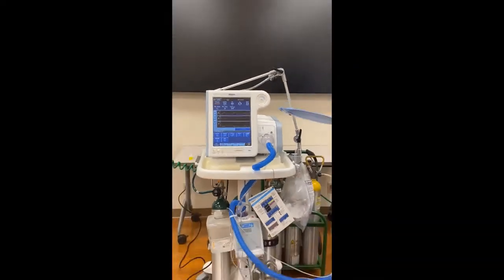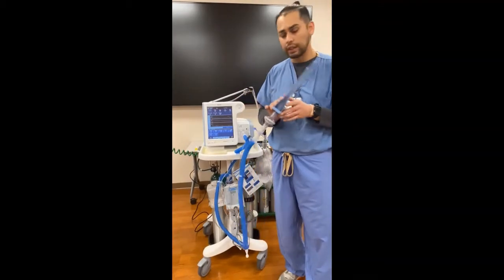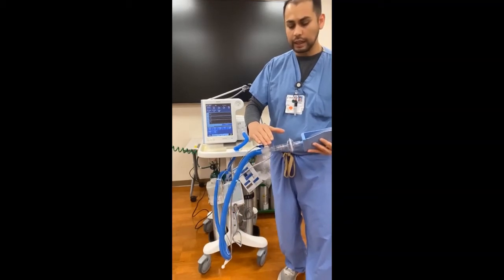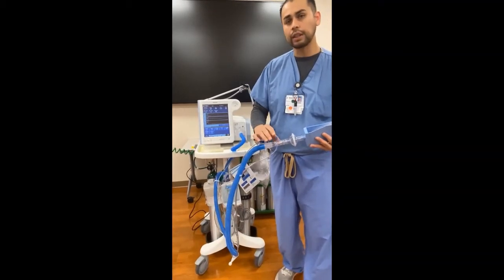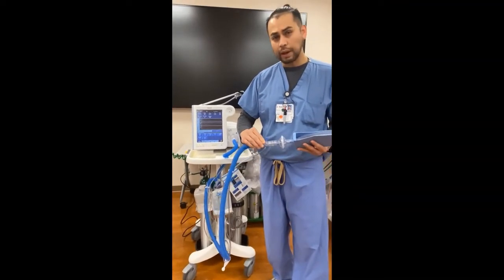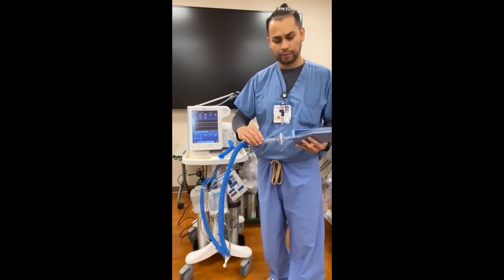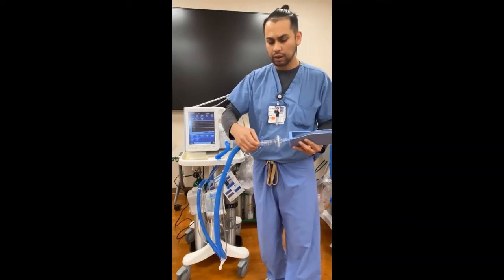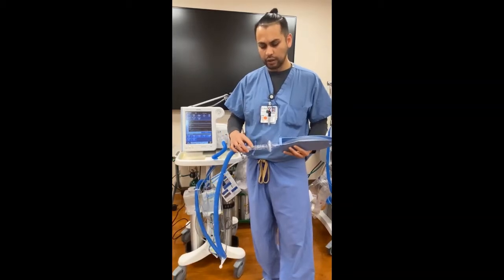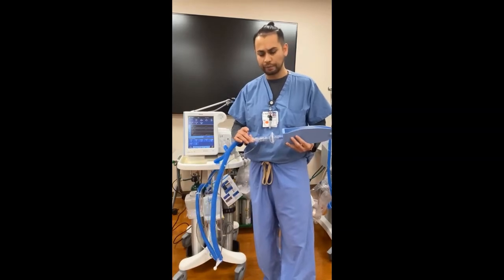Now, as you notice, we have a test lung attached to it, and we have the corrugated tubing, it's one single tube, and we have a little bit of pressure, a little bit of air that is leaking out of here. This is important to keep open. We do not want to occlude it because that will be bad for the patient. They will accumulate CO2 because this is their exhalation port. Anytime the patient is able to breathe out, this is where the air gets excreted, okay? So we definitely don't want to keep this occluded. We want to hear this little bit of pressure coming out of the circuit, okay?